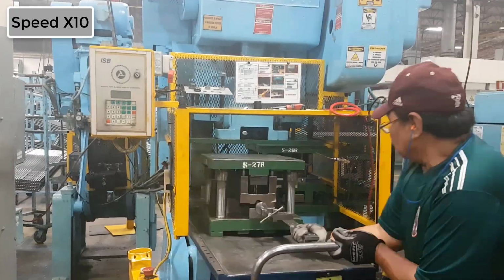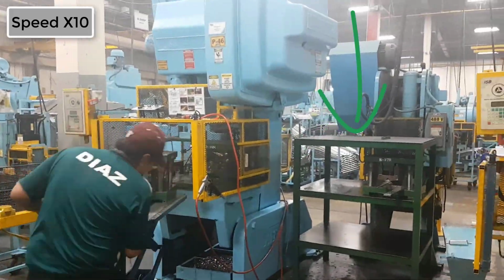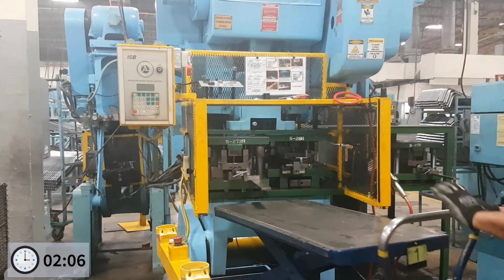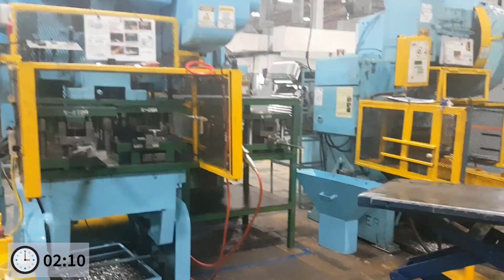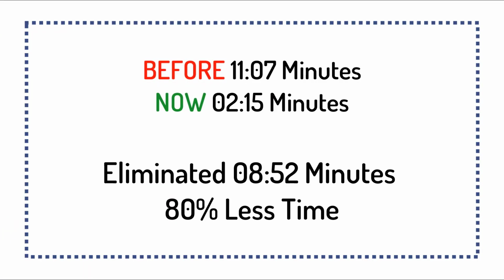And as you can see here, the main improvement consists on placing a rack for dice just outside the machine and eliminate all the travel distance to the dice room. On before situation, the setup guy had to walk 890 feet, taking 11 minutes and 7 seconds. After the improvement, only 102 feet, taking 2 minutes and 15 seconds.